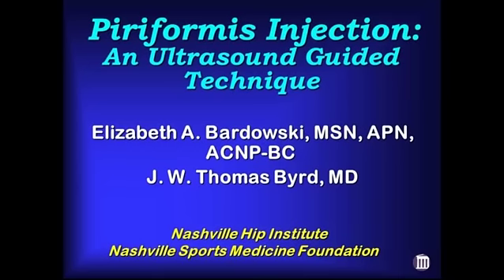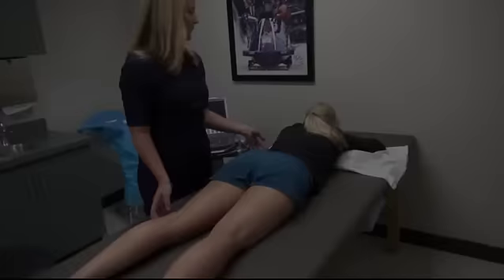This video details an ultrasound-guided injection of the piriformis. An ultrasound-guided piriformis injection can be easily performed in a clinic setting.